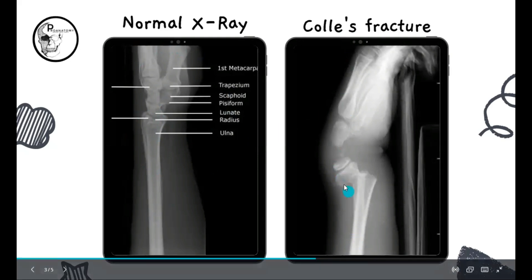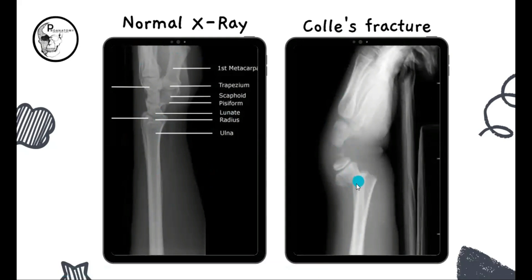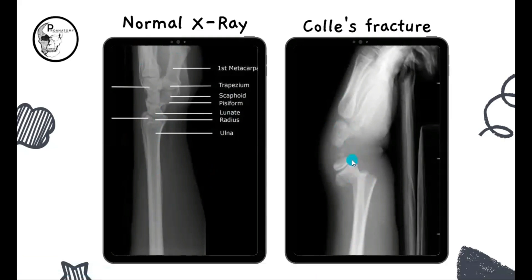Now let's compare it with a Colles fracture X-ray. Here you can see the carpal bones are slightly displaced. And here you can see the lower end of radius is fractured almost 2.5 centimeters from the end. This is the distal end of the radius, and almost 2.5 centimeters above from there, there is a fracture and the fractured fragment is displaced backwards. That is the typical presentation of the Colles fracture.